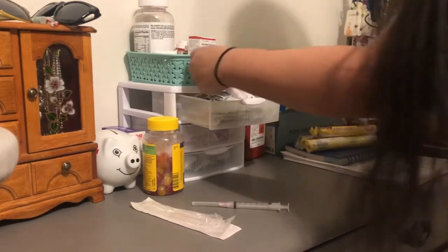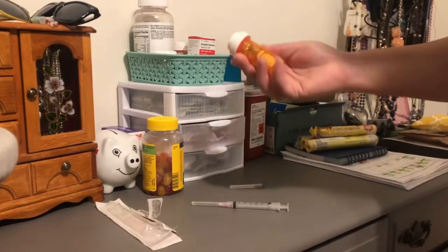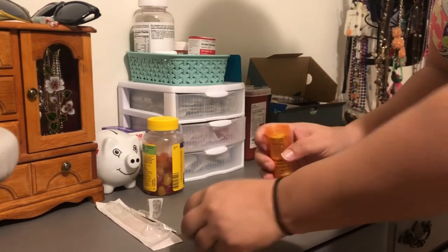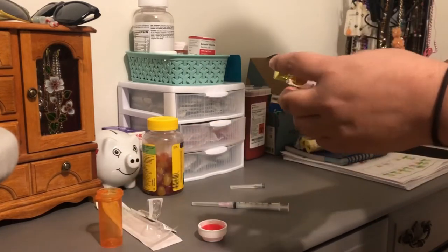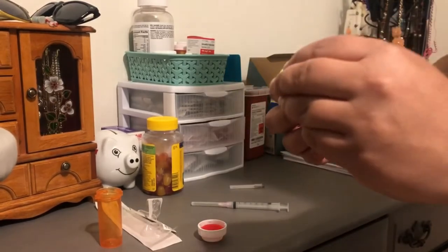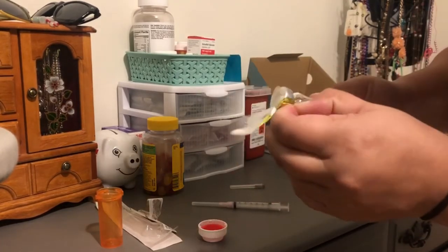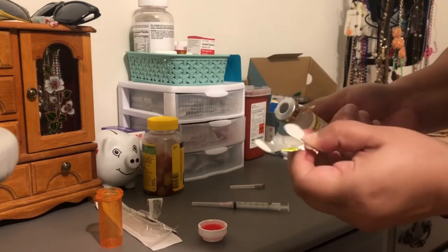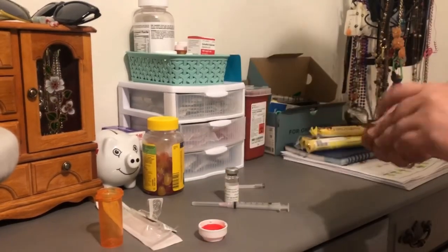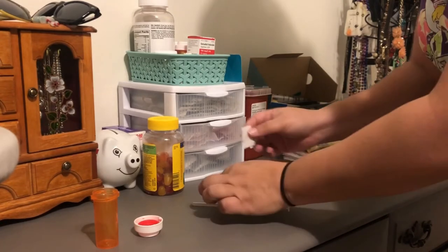And then I'm getting my injection needle — same as before. This is what my progesterone in oil shot came in. Wow, that is big. The bottle has foil and a little sticker protecting the top. It looks kind of like the shots I've been doing, so same thing — I'm going to alcohol swab the top.